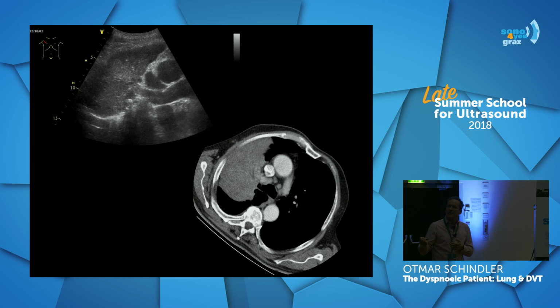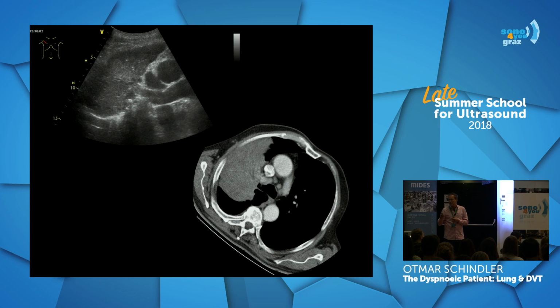Yeah? And as you can see here, with the ultrasound probe, you nearly see the same thing as in the CT. Yeah? You don't need the CT anymore. No, we don't. We do need the CT, of course, but if you have a good ultrasound probe, if you just put it on your patient, you can see quite a lot of things, and you can really diagnose without putting the patient in the CT first. You can just start your treatment and then you see what's really going on, okay?